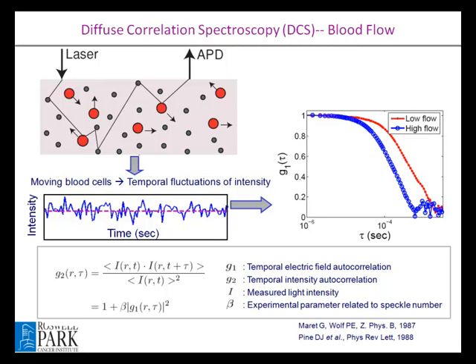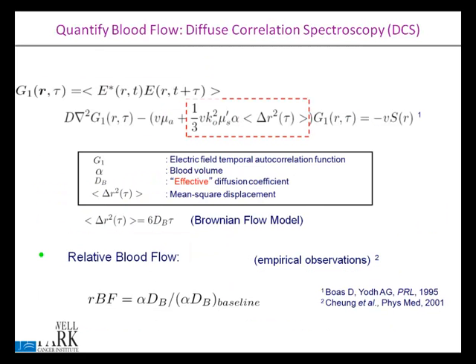But if you are moving around to get, let's say, pizza, I may sometimes catch you on the same spot, so the probability will decrease. If you are moving too much, the possibility of seeing you on the same spot will be less. It is the same idea. If the autocorrelation function decays quickly, then we have more blood flow, and if it decays less, then we have less blood flow, which you can see on your monitors.